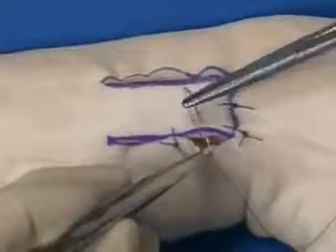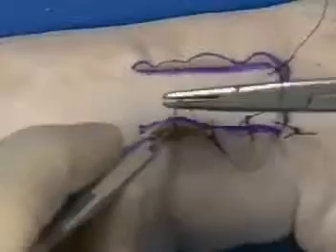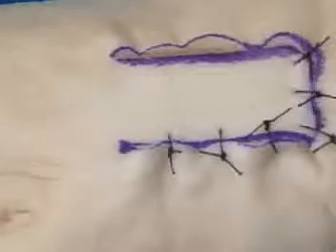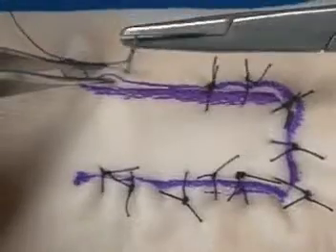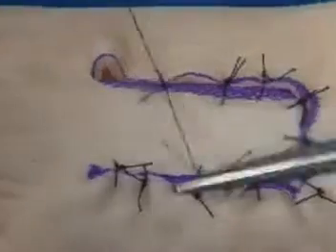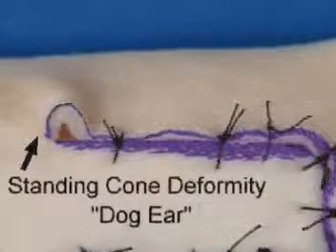Subsequent sutures are then placed so that each splits the difference between the previous sutures until enough sutures are placed for adequate closure. In this way, the redundant skin of the lower flap is spread evenly across the entire wound closure and results in a smooth wound edge. On the upper flap, we have closed it so that the skin is closed in an even manner, resulting in a standing cone deformity at the inferior aspect of the flap.